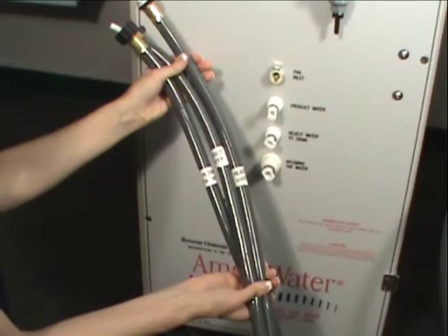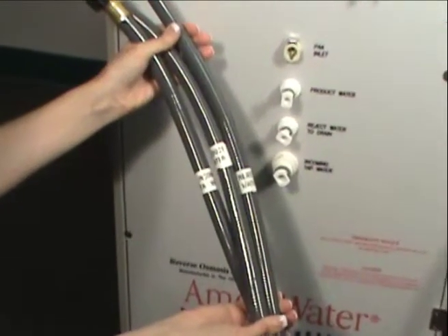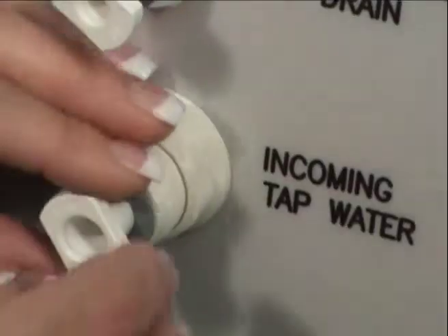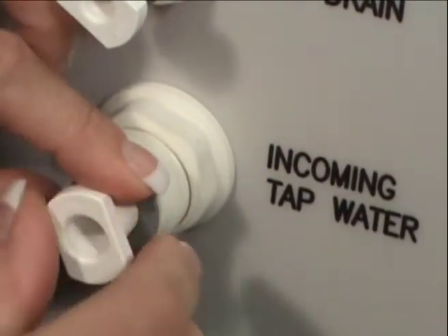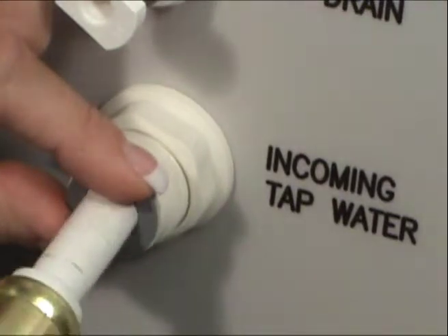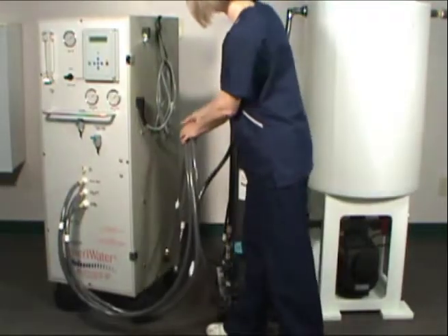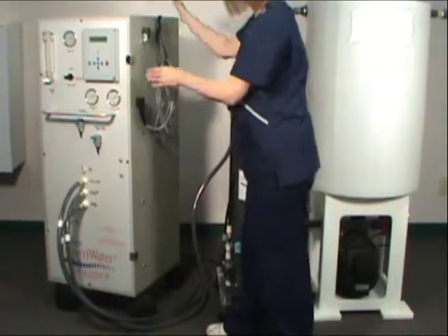Attaching the hoses is simple. Each hose is labeled with names that match those on the front of the unit. The temporary fittings are removed by pushing in on the fitting, holding the ring in, and pulling the fitting out. Each hose attaches simply without any tools. Once attached, the hoses are wrapped around the right side of the unit so the RO can be turned around easily for service.